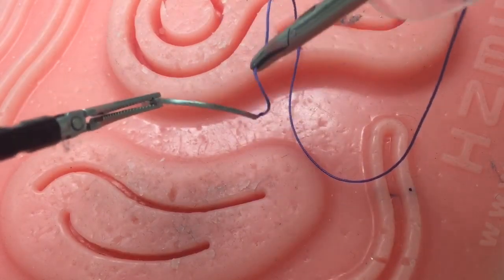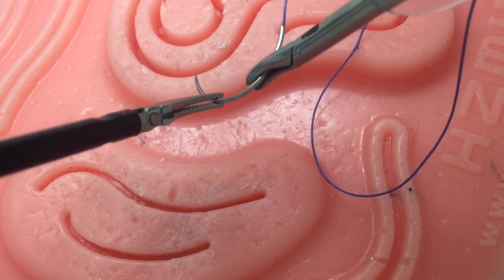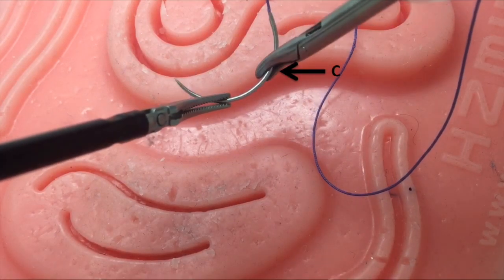Needle loading. Swivel the needle such that the light evenly reflects off point C. Then, using the needle driver, grasp the needle firmly at point C.